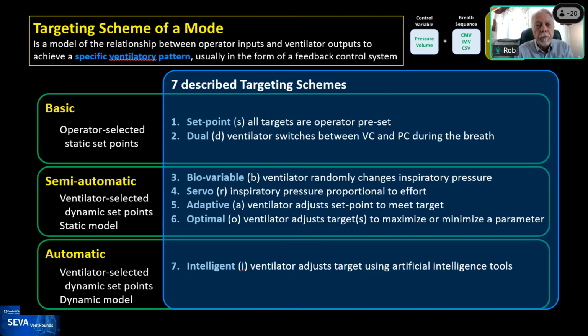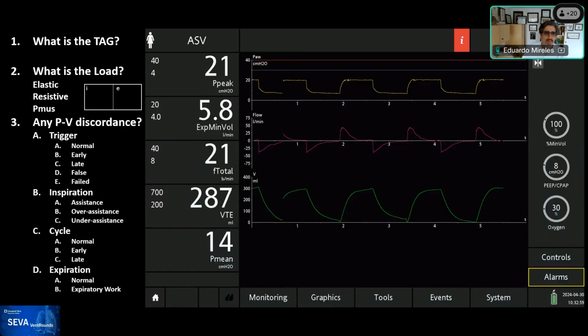Yeah. So now that we have put these targeting schemes here, I thought that it would be a good exercise to go through a mode as we usually do, and then we'll focus a little bit more on the targeting scheme for that mode, if that is okay with the team. So this is actually very fresh. It's from today, April 30th, 2024. I was walking around with Samin, who is one of our high-quality respiratory therapists, and he had placed a patient on this mode. So let's start our VentRounds.